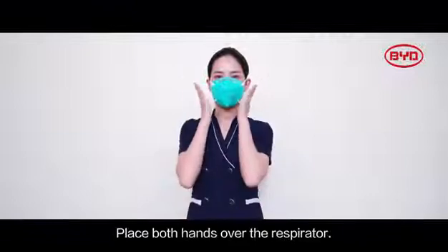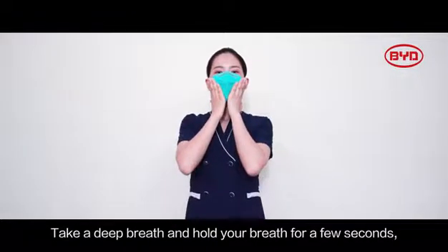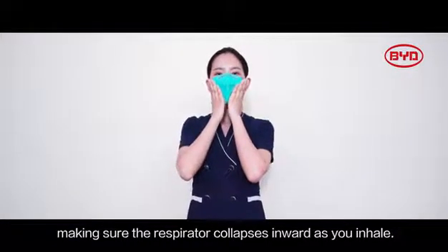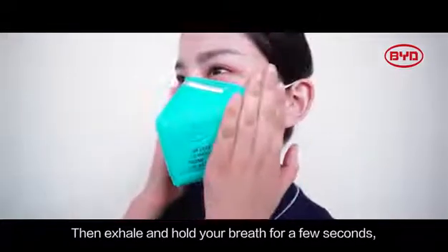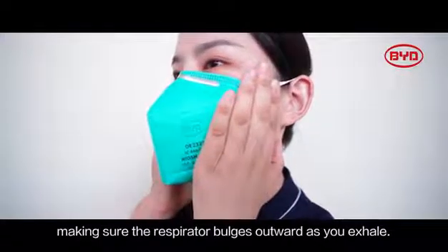Place both hands over the respirator. Take a deep breath and hold your breath for a few seconds, making sure the respirator collapses inward as you inhale. Then exhale and hold your breath for a few seconds, making sure the respirator bulges outward as you exhale.